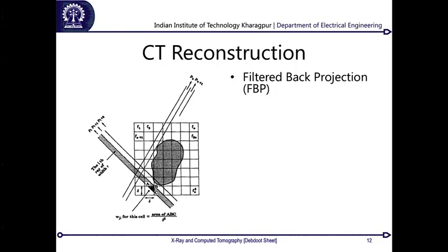Now the downside is obviously, since it is in the Fourier domain, you have a higher computational complexity associated with Fourier domain processing. Other downsides are that your Fouriers are not infinite here, you are just doing a fast Fourier transform or a discrete Fourier transform. So you are basically limiting the number of frequencies you are taking. With the limited number of frequencies, you are losing high frequencies, and so you will have the same effects with ringing or missing frequency problems which are present in images as well.